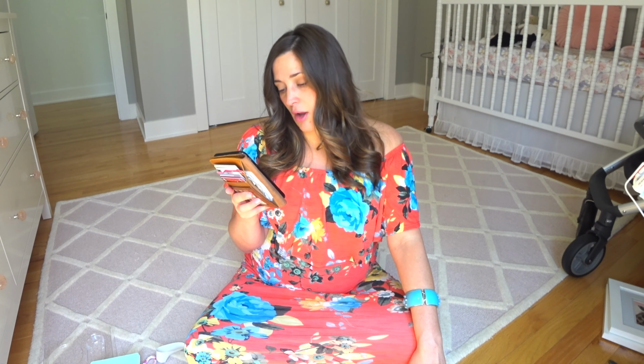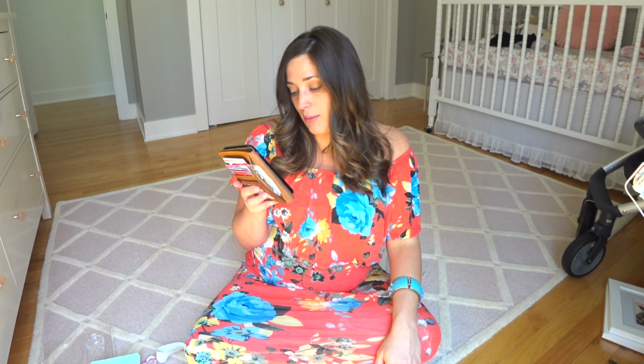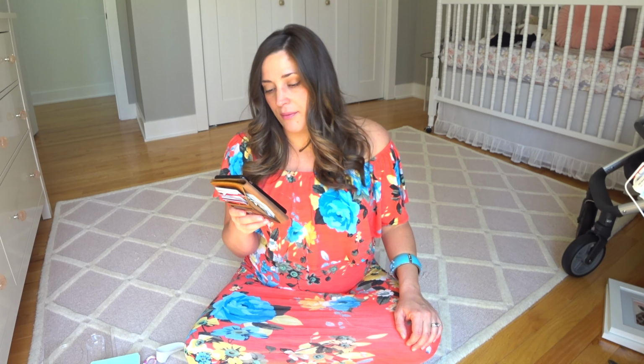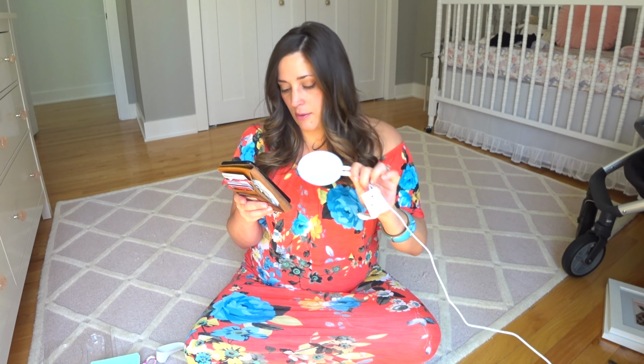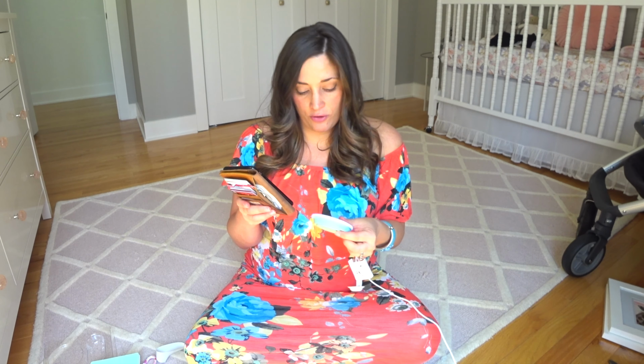Because your baby hasn't been born yet, Owlet will prompt you to fill out this information. It says, now bring all items, the smart sock, the base station, the smartphone, into the same room where baby sleeps. Plug in the base station near but not in the reach of the baby's crib. Base station colors. It glows 5 different colors to signal you. Static white means it is plugged in and charging. Blinking green, it's looking for readings from your baby. Slow pulsing green, it's either receiving readings or sensing movement.